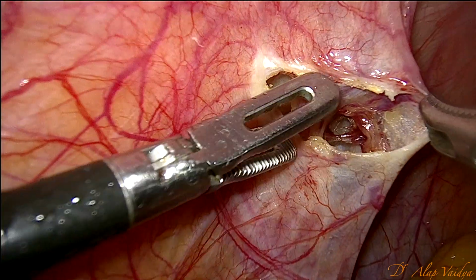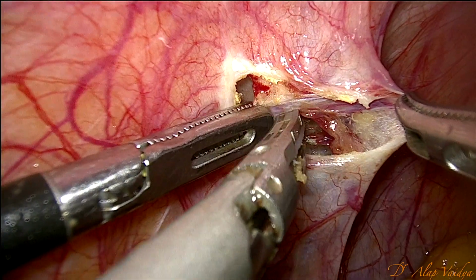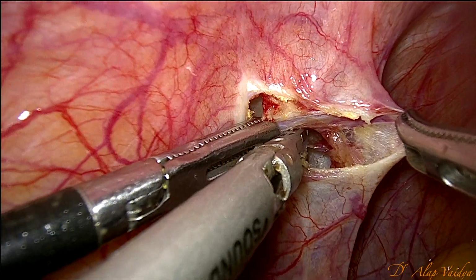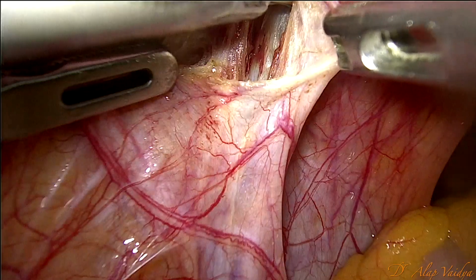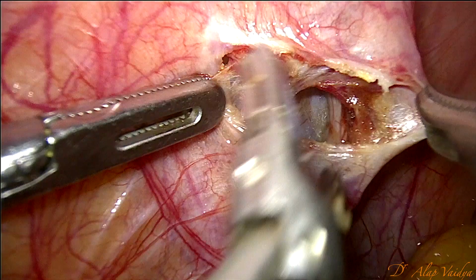This is a good case for demonstration as we can see the uterine artery easily, but we never coagulate the uterine artery without seeing the ureter. That we can now see here in yellow, and also see the beautiful relation between the uterine artery and ureter.